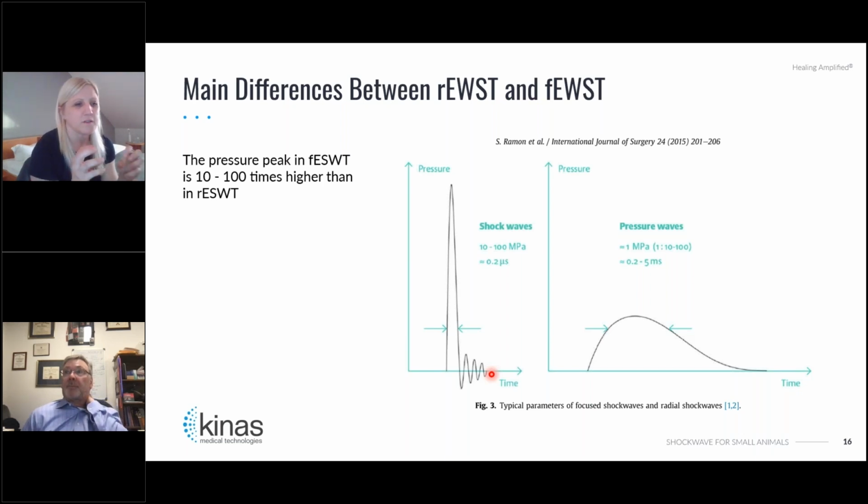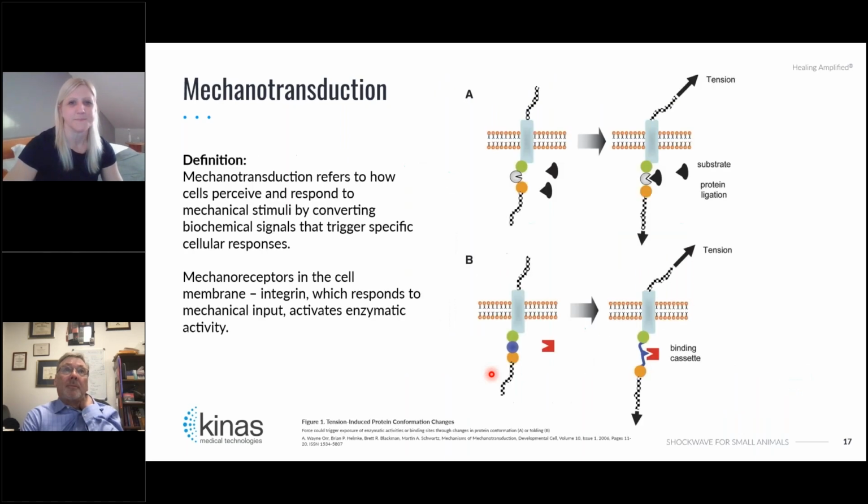And if you want to get some, maybe even some regeneration and proliferation, migration of stem cells into the treated tissues. So that's what you want to look at as well.